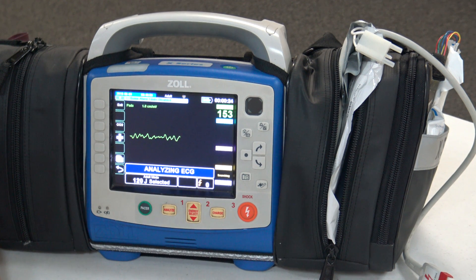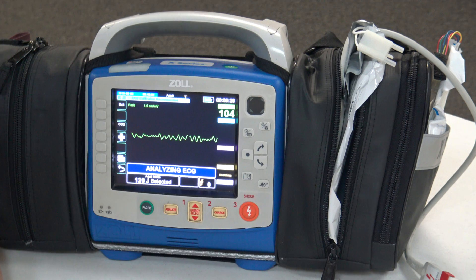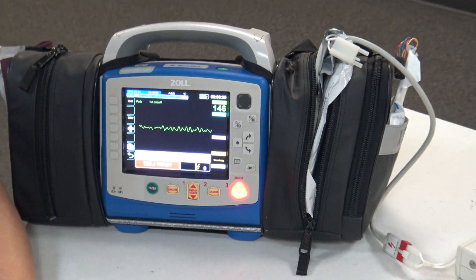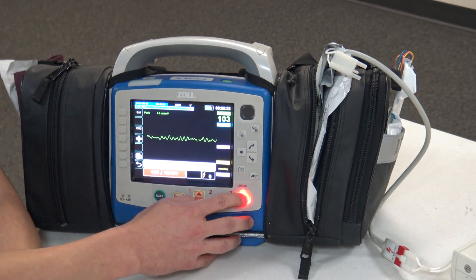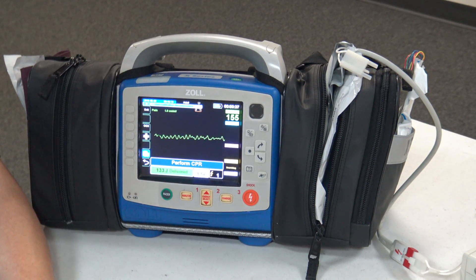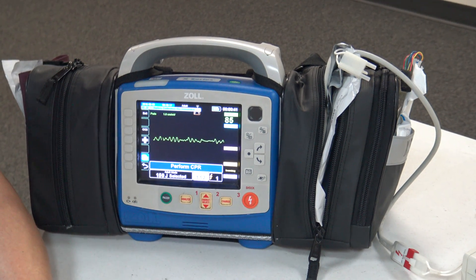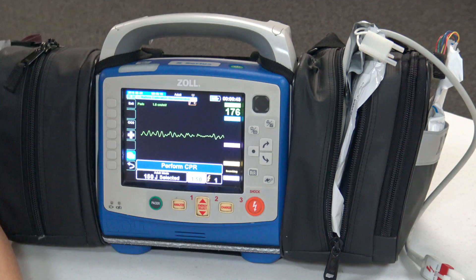Stand clear. Press shock. So what this has done is analyzed our rhythm for us. It's administered a shock at a predetermined amount — 120 joules on the first one, 150 on the second, and 200 on the third.